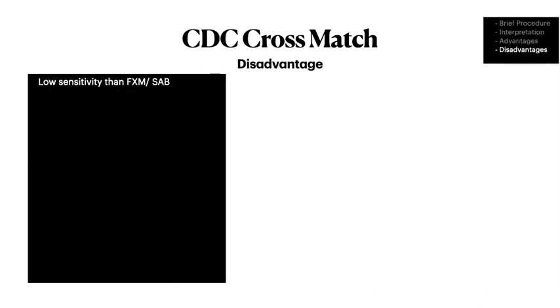The disadvantage of the CDC cross match is that it has low sensitivity, lower compared to the flow cross match and SAB.